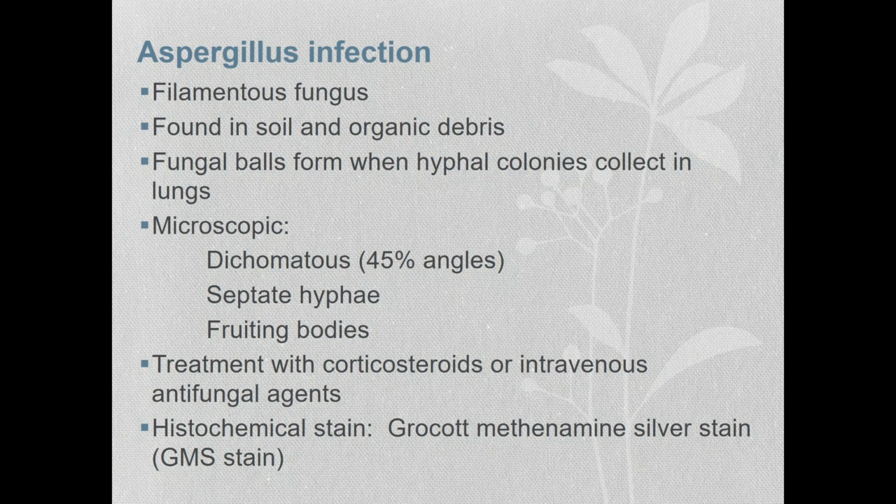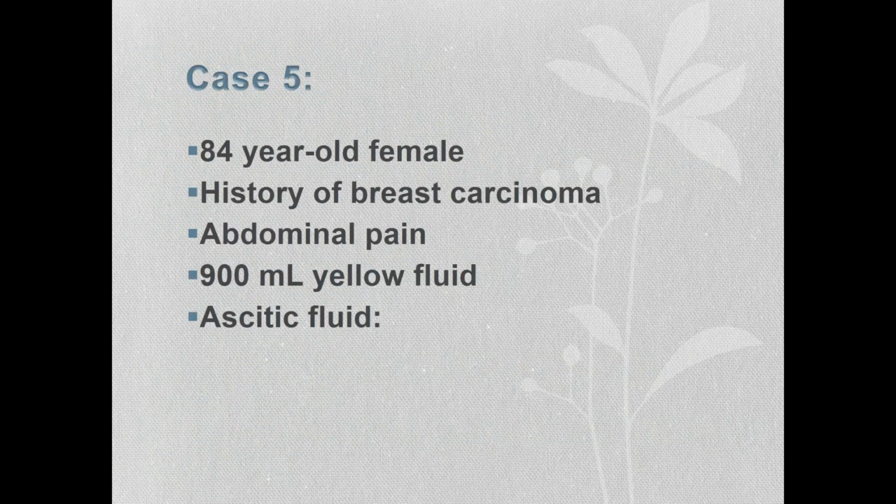And then the Grocott methenamine silver stain, or GMS stain, we do perform a microwave technique, which is a modification of this stain in our laboratory. Our cytopreparatory technologists do all of our silver stains. So let's move on to case number 5.